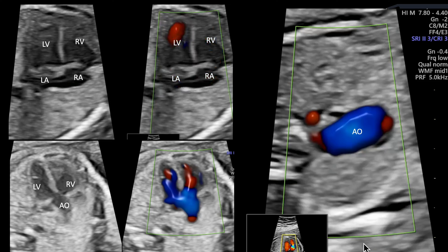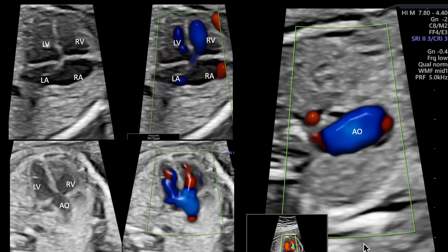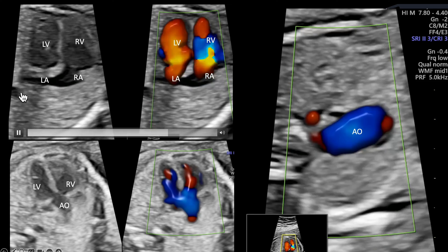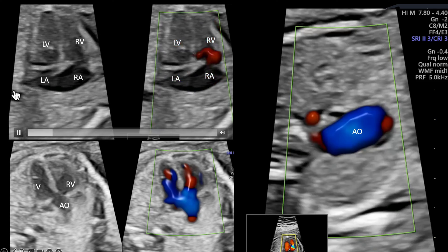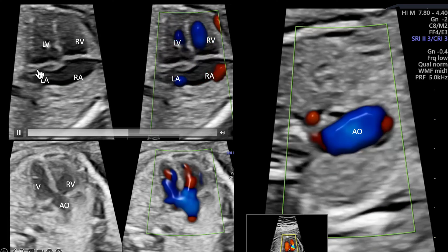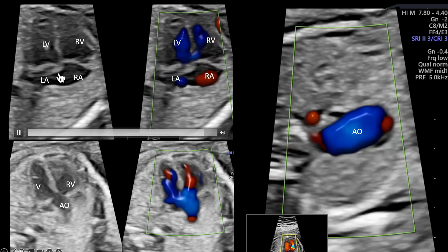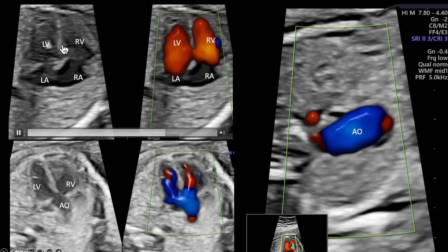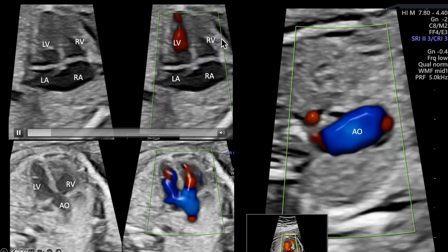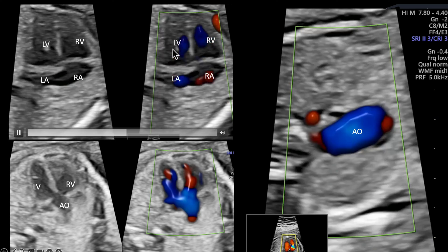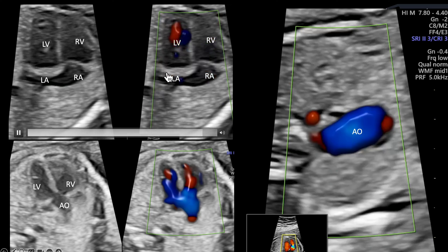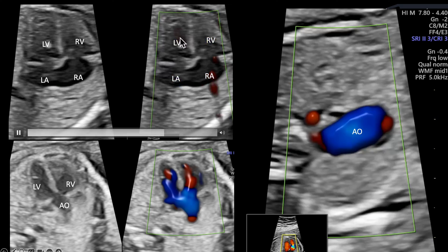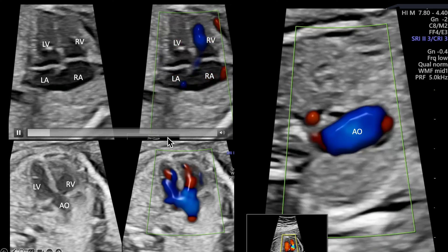This looks like a very good simple four-chamber view which looks normal. This is the descending aorta, this is the left atrium, left ventricle, interventricular septum and the axis is normal, right atrium and right ventricle. Both chambers are normal sized and RA and RV are also normal. The interventricular septum at least at this part looks intact.